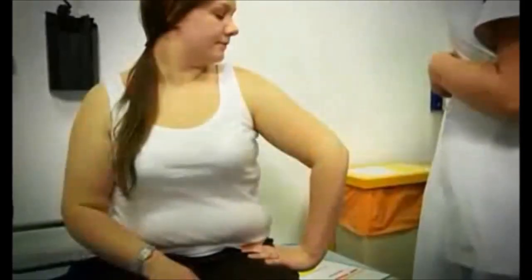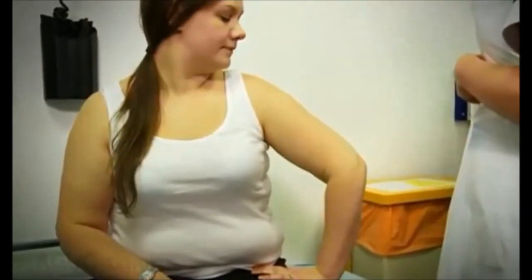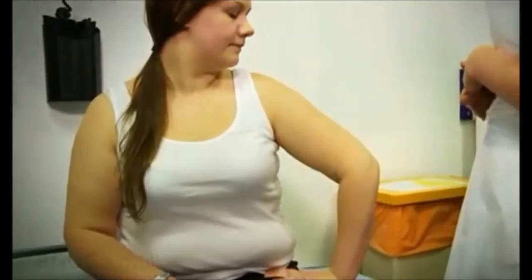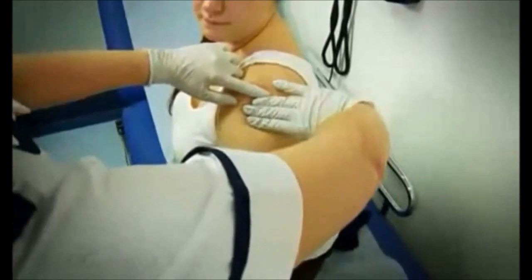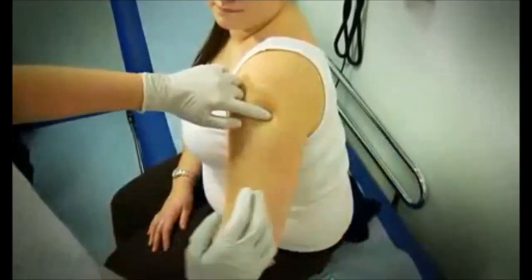The deltoid muscle is located laterally on the upper arm. To emphasise the contour of the deltoid, ask the patient to place their hand on their hip, which abducts the shoulder and flexes the elbow. The bulk of the muscle lies from the lower edge of the acromial process to the midpoint on the lateral aspect of the arm in a line with the axilla. The intramuscular injection is given approximately 4 to 5 centimeters or 2 to 3 fingers width below the acromial process.